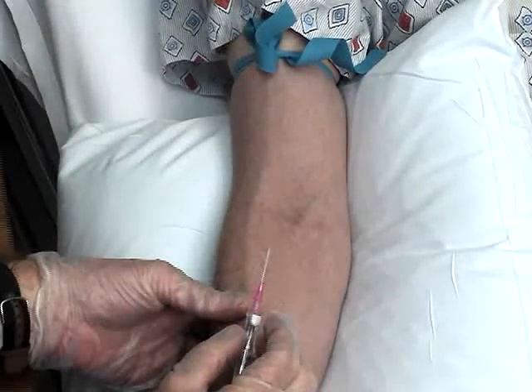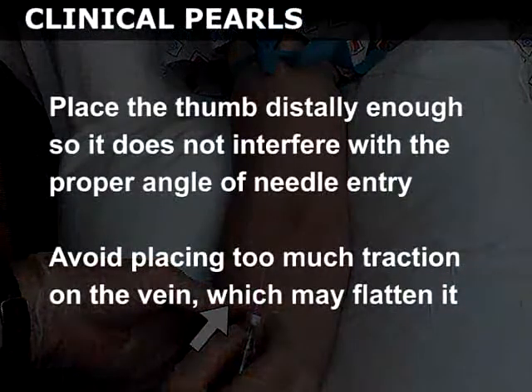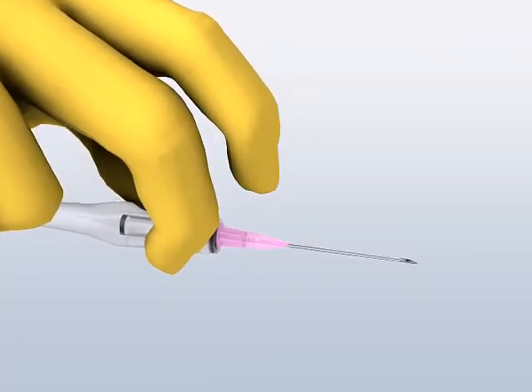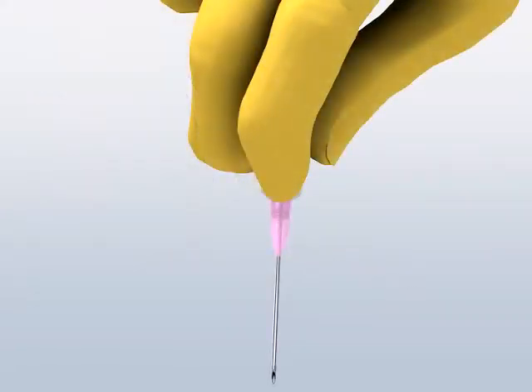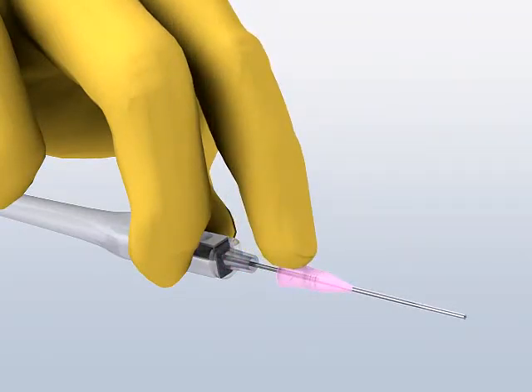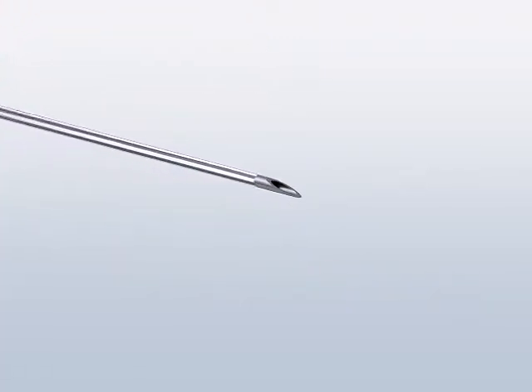Apply traction distal to the vein with the thumb of your non-dominant hand to prevent the vein from rolling during cannulation. Place the thumb distally enough so that it does not interfere with the proper angle of needle entry. Avoid placing too much traction on the vein, which may flatten it and make the procedure difficult. Hold the intravenous catheter at the level of the flash chamber, between the thumb and the middle finger of your dominant hand. You will use your index finger to advance the catheter over the needle and into the vessel.